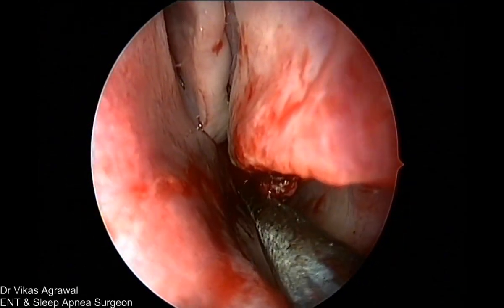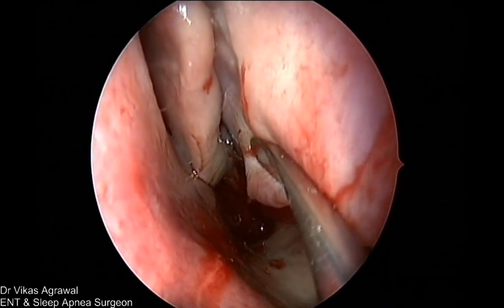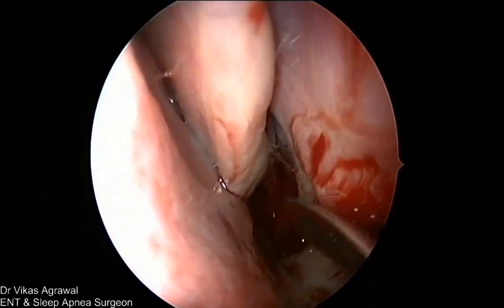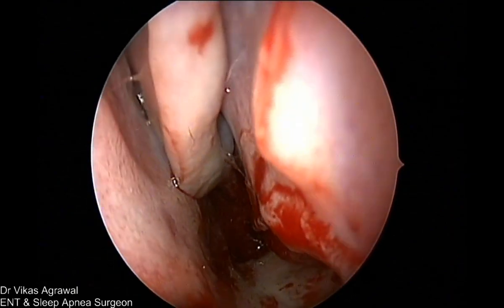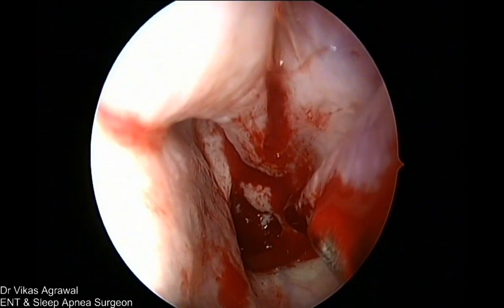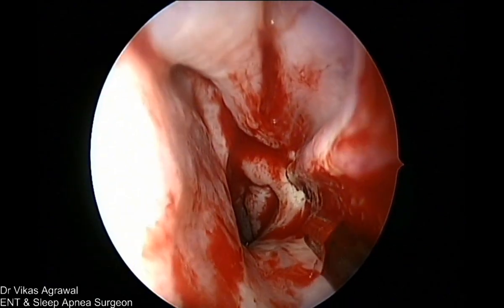And the middle part, obviously, we should always lateralize. So the moment we outfracture the inferior turbinate middle part, you can see how much space has been created, and we have almost saved all of the turbinate except the part which was not useful. And we'll just do a suction cautery here. Now packing with suture packing, the airway one.